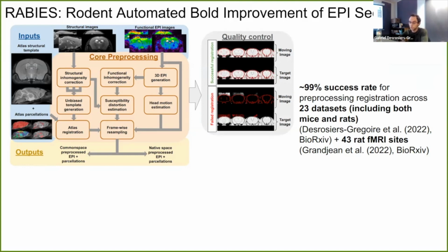This workflow has been tested on a range of different data sets in both mice and rats, as documented in my current preprint, or more recently by Johannes' multi-site rat study, where he used even more data sets than me. And we've achieved very high registration quality after tuning the workflow properly. So hopefully you can manage almost any kind of images you might give it as input, if it's properly formatted to begin with.